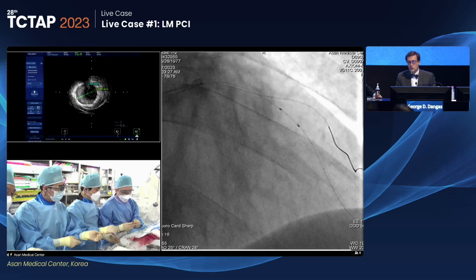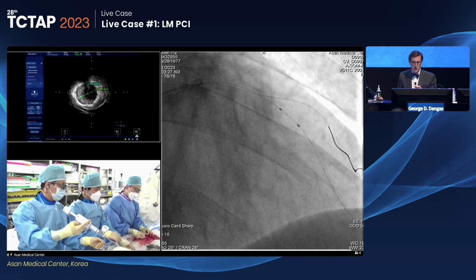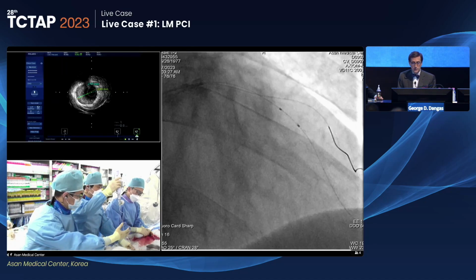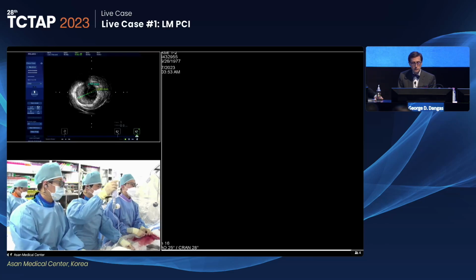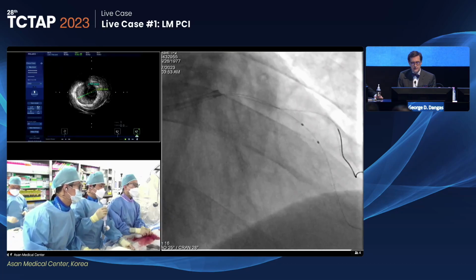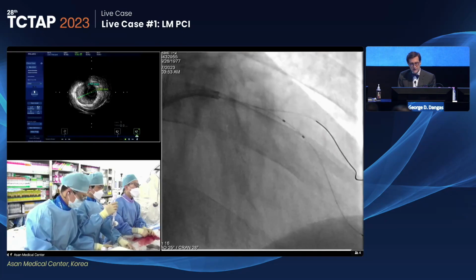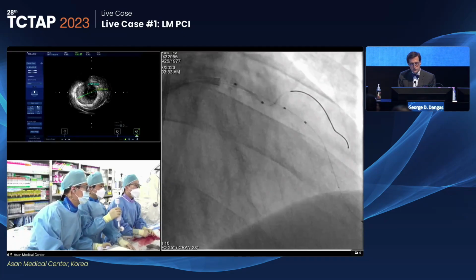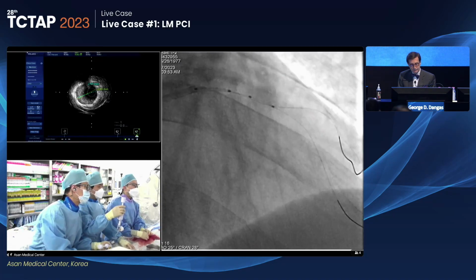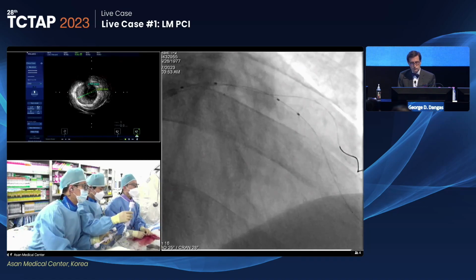This is 2.5 stent again. Well, it's mostly an alignment situation because of the angulation. So hopefully after this high pressure balloon, I don't know, we'll need the anchor, but it's good to have it. Okay, I'll try. I wonder if it makes the equipment too tight into the guide, because you already have a balloon in and you're trying to deliver a stent. Oh, it's deep support. I still have the difficulty in crossing the stent.